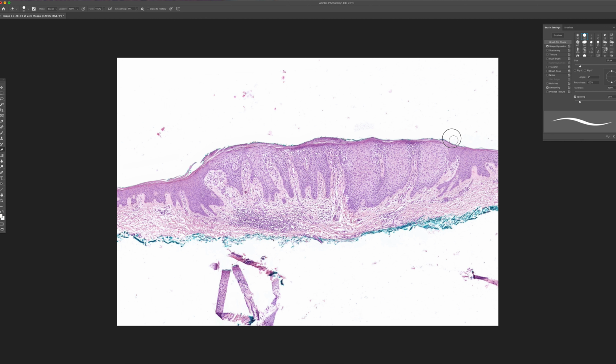One always has problems with pale sections, and they're sometimes very difficult to make nice, particularly, I'm going to the bottom now, particularly if the lighting is not perfect. One of the problems with Photoshop is when one's looking at a section where the lighting's not in the center, very often what you do in Photoshop just makes the problem worse.